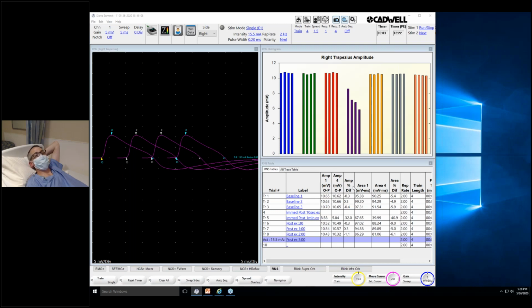We're going to demonstrate the facial nerve. I think we have time, right? We're good. Yeah, we have time. So we're going to demonstrate the facial nerve. It is an important nerve. Again, myasthenia gravis often affects bulbar muscles alone without limb muscles. I won't be crying, so I can't demonstrate crying, but you will see how this can be kind of difficult.